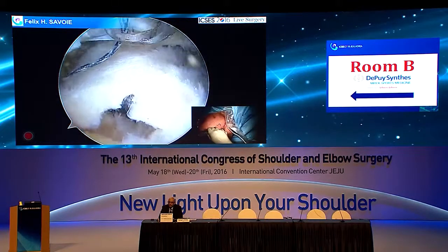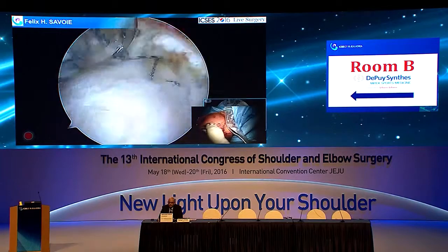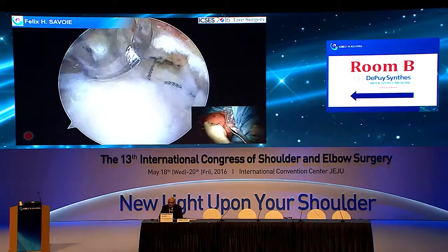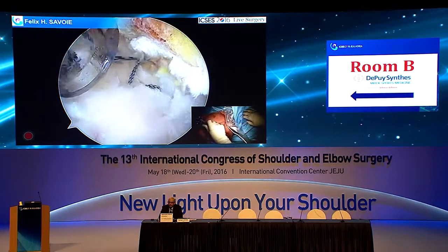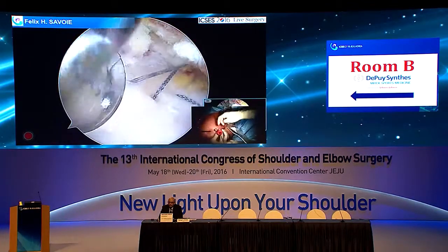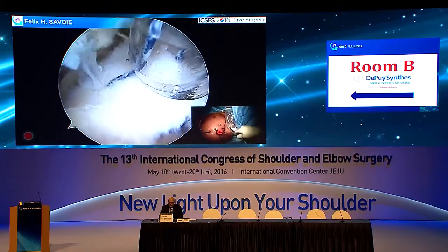So for me, I like to tie knots. I know it's not the same for everyone, and there's some compelling evidence that maybe that's not the best thing in some patients, but my goal is to make sure that I get my medial row stabilized. Okay, I will tie. So can you hold that for a second?